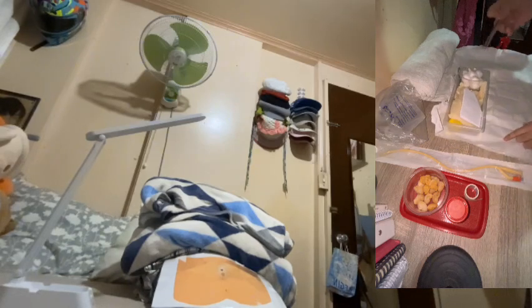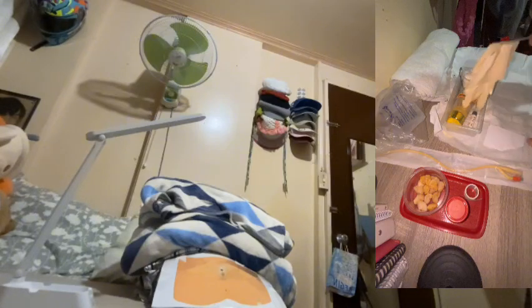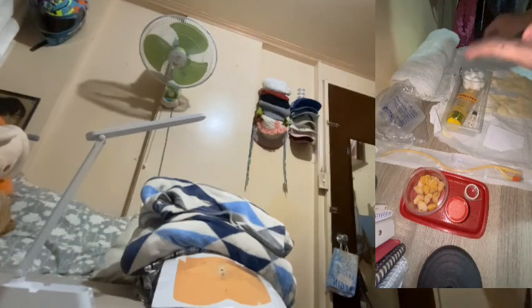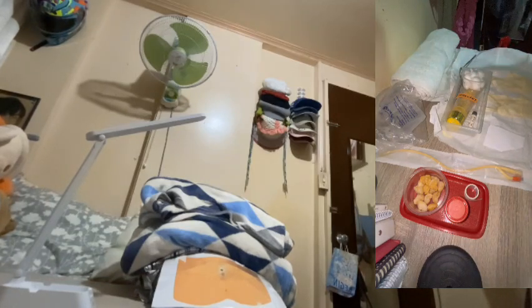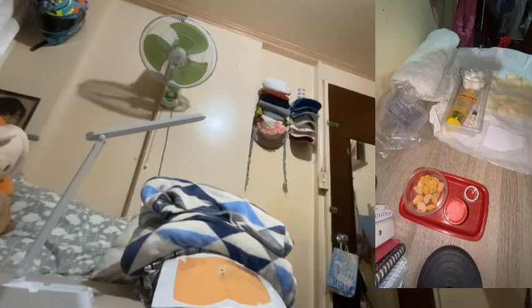So we have here the eye sheet, the sterile gloves, then we have the sterile pick-up forceps, the lubricant, the 10cc syringe filled with sterile water, the cotton balls, and now we're gonna open the catheter so that later on we do not get the catheter contaminated.